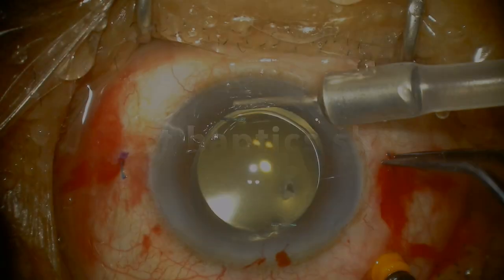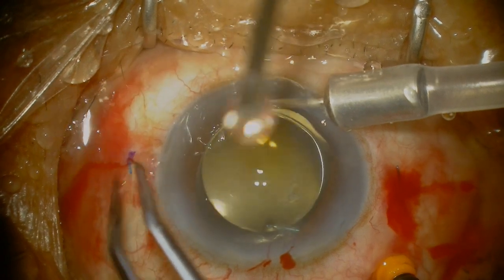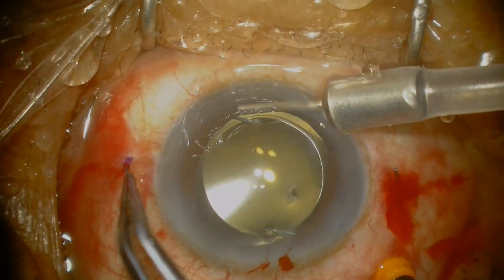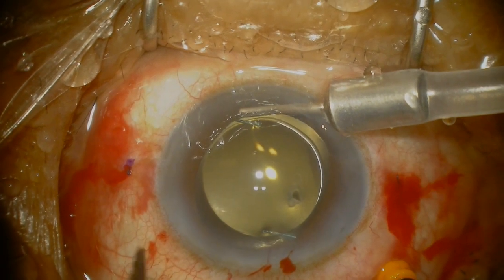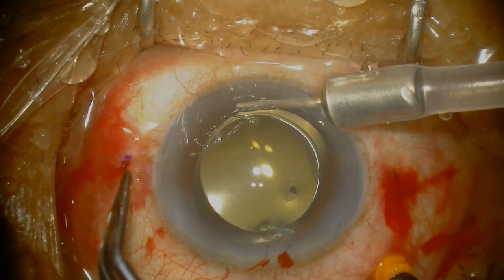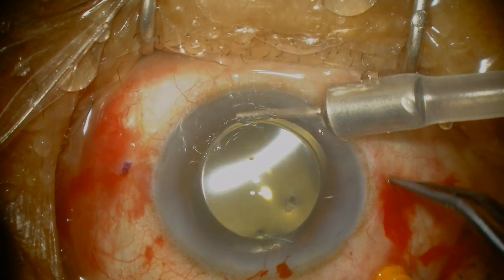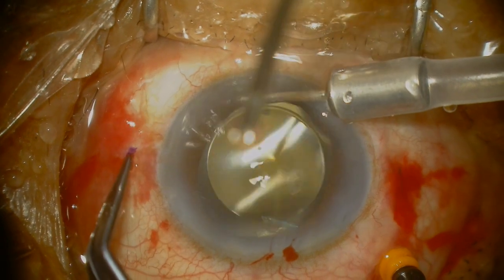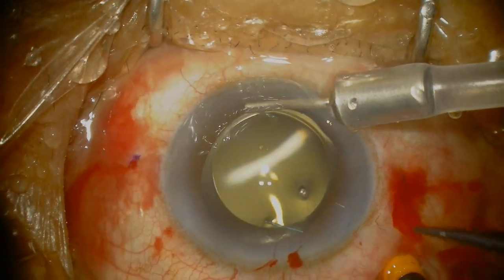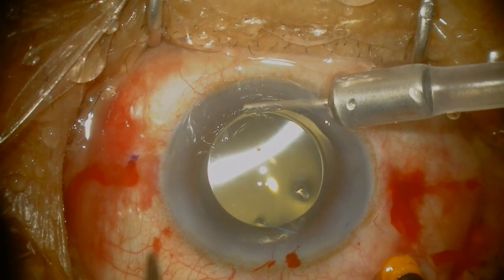You want to adjust the haptic slowly — push a little bit at a time, keeping your eye on the centration and whether there's any significant tilt, because any of that can still be adjusted if it's not too significant. Small decentration, a small tilt — you can actually cut the haptics and adjust. When you see that the centration is good, push the ends of the haptics, the flanges, back into the scleral tunnel to ensure that they are flush.